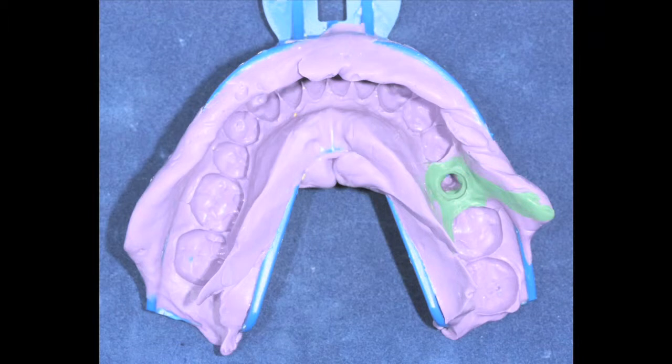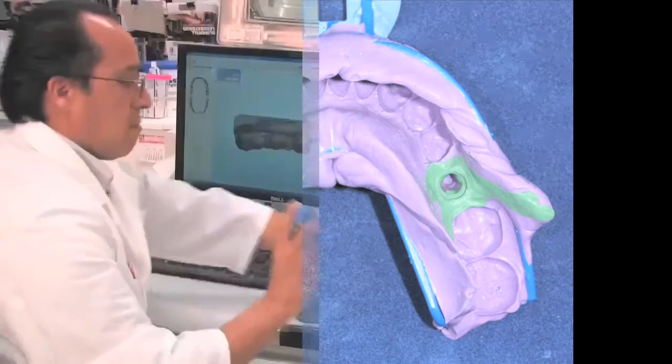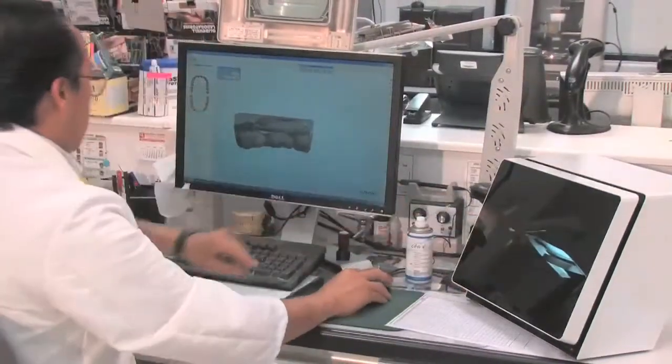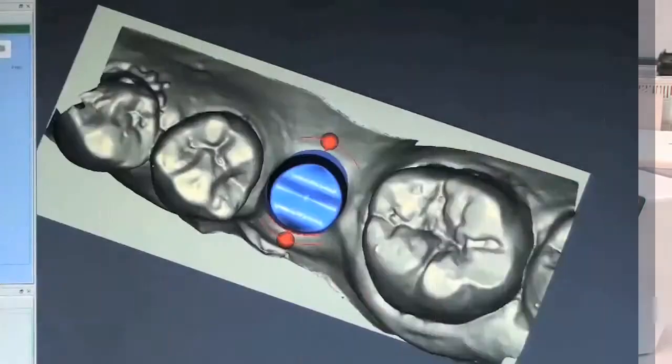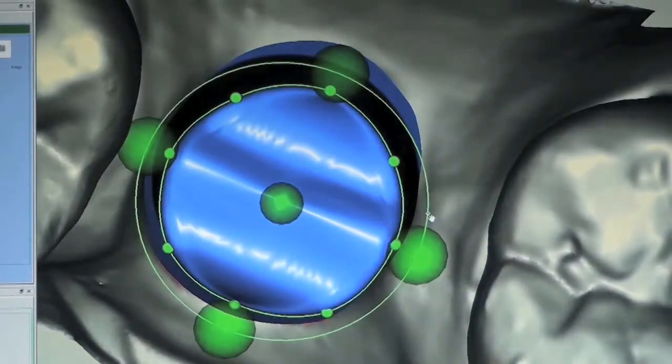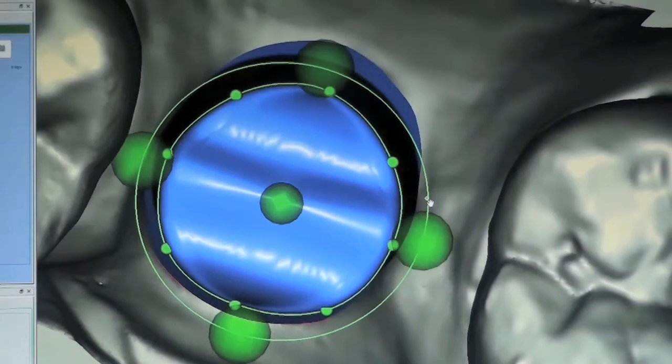Following a healing period of approximately 3 to 4 months, an implant level impression and bite registration were made. These were sent to the laboratory with the opposing model. The master cast was then fabricated and optically scanned. For strength purposes, I requested a custom titanium abutment and a porcelain fused to metal crown.